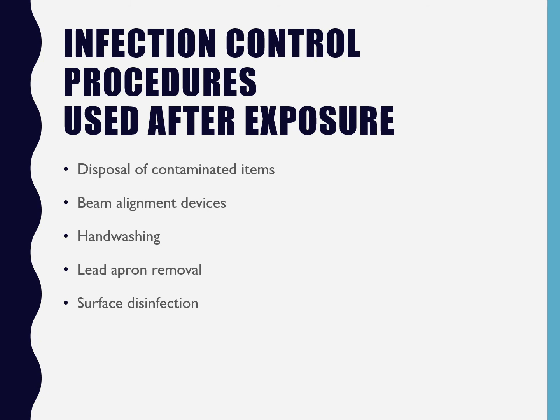Or Miss Janice or Miss Cozero is going to be there with you, and they're going to say, okay, print those out for us. And then you're going to dispose of any contaminated items. So all of your garbage, basically.